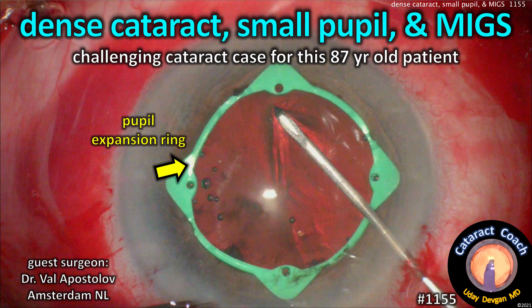CataractCoach.com. Dense cataract, small pupil, and MIGS — a challenging cataract case for this 87-year-old patient.